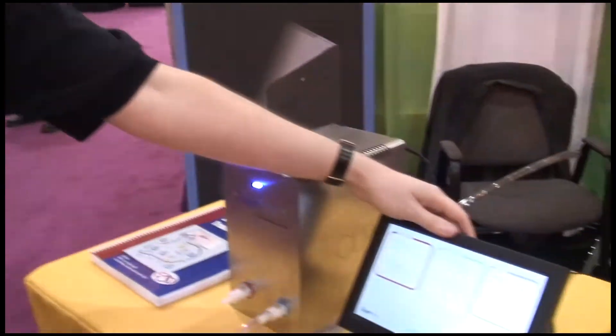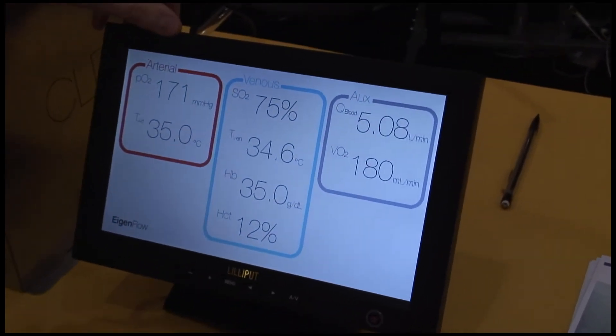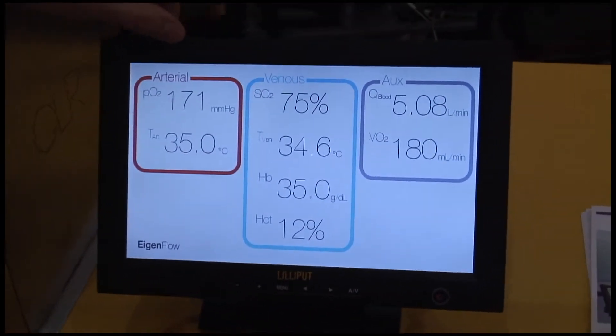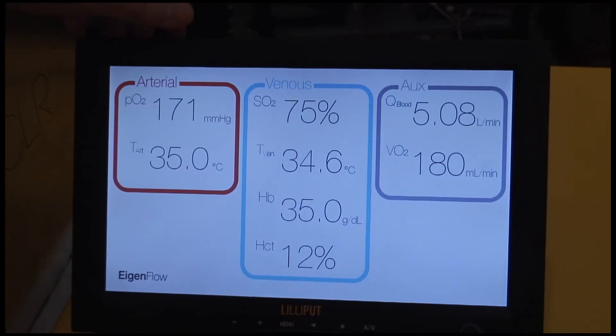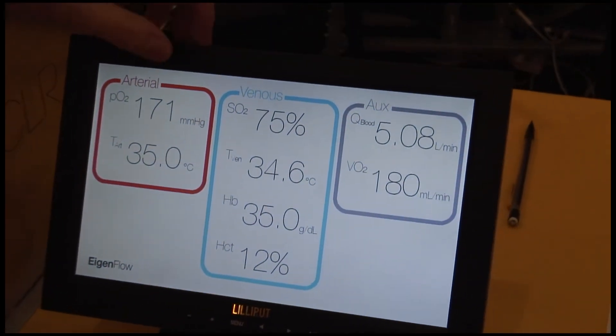Over here in the system we have a blood monitor. These blood parameters are used by perfusionists and some are used by ECMO specialists. We designed this mainly for ECMO, but if cardiac bypass perfusionists want to train on this too, they can do that as well.